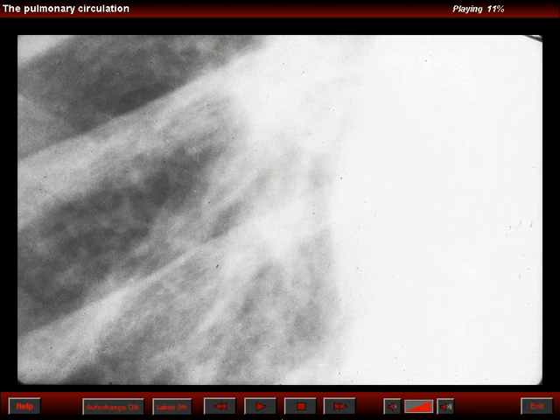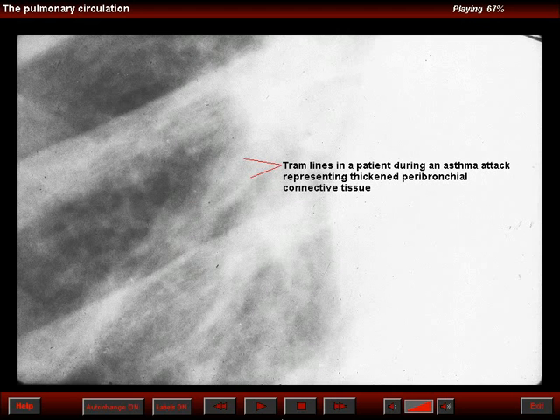Dr. Heitzman has described tram lines in patients during an acute bronchial asthma attack, as seen in the right base of the chest.